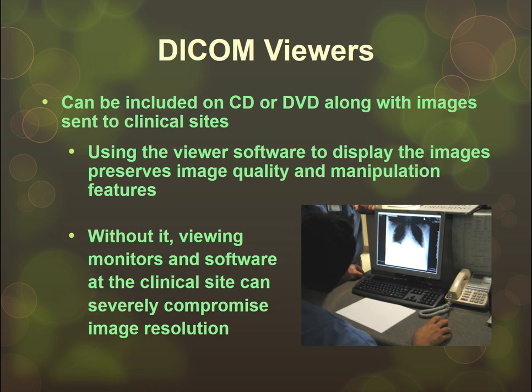DICOM viewers. These are included on CDs and DVDs along with images sent to clinical sites. And it's real simple. There's DICOM 1.0, DICOM 2.0, and DICOM 3.0. There's 3 versions of DICOM out there. And so if we just sent the images on a CD and we burned them using DICOM 2.0, it probably wouldn't work if your hospital is using DICOM 1 or DICOM 3. So the best way to avoid those kinds of problems is to just include a viewer using whatever version of DICOM you use at your hospital onto your CD or DVD.